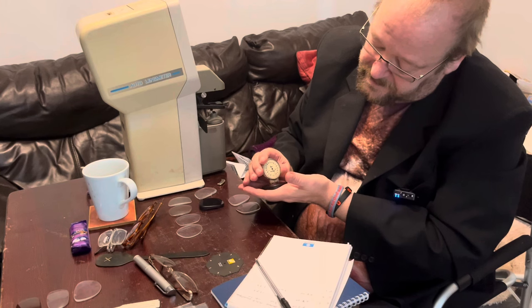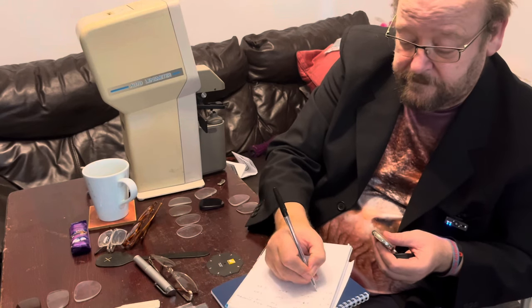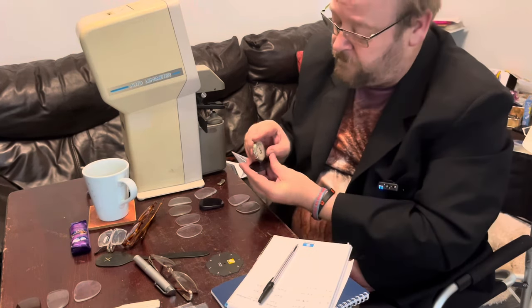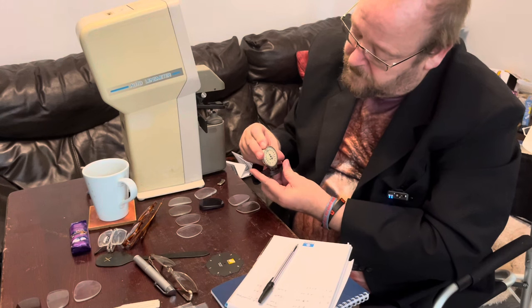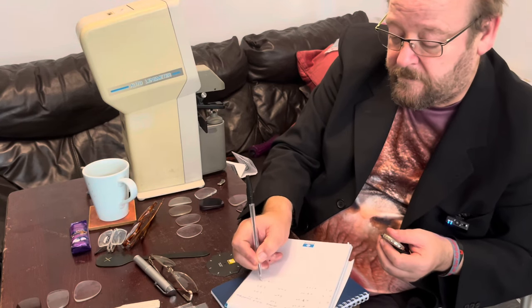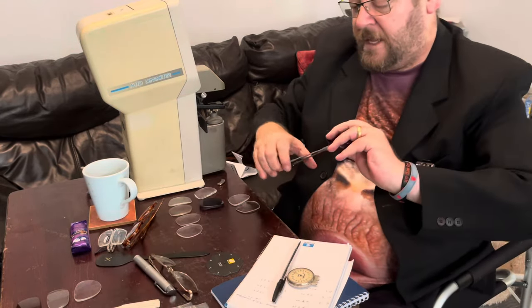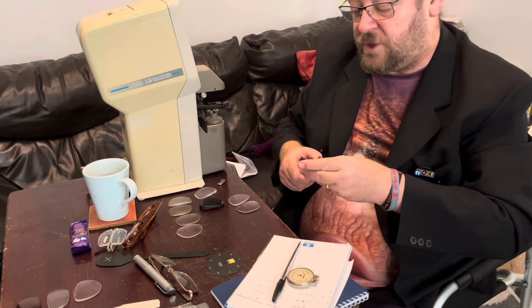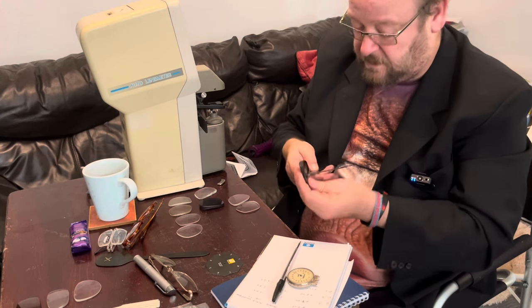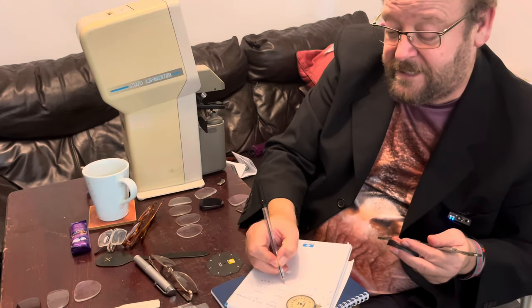The front surface is plus one. The back surface is going to be quite a high reading — that's minus 9.25. And now for the center thickness of the lens. For a minus lens you'd be measuring the outside edge to get the true thickness, but the center thickness is two millimeters. So you'll notice that even though that's the highest prescription so far, it's actually the thinnest center.